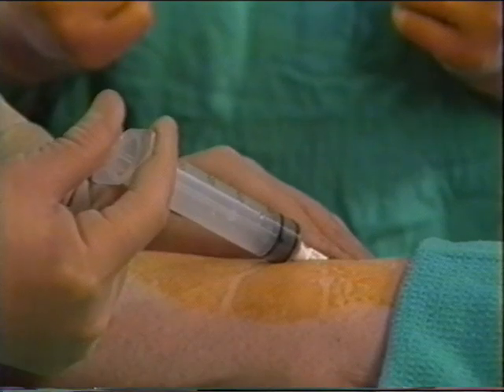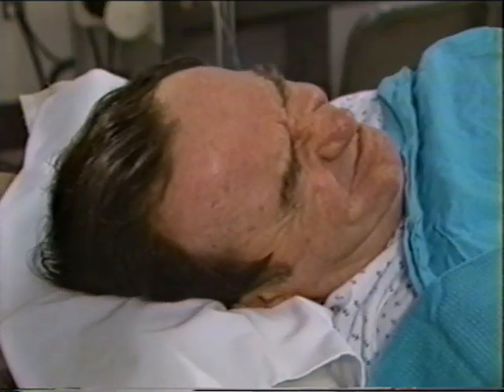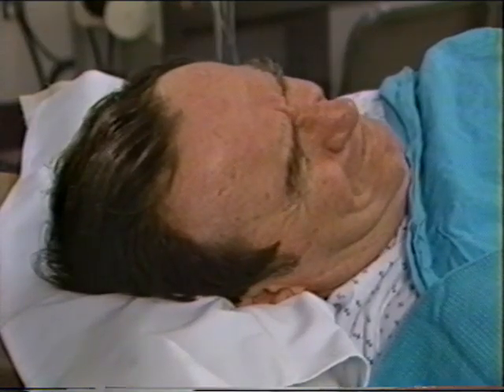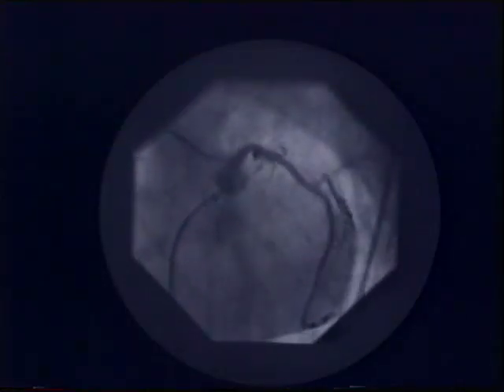Injections may be made into the coronary arteries and also into the heart chamber. During the time the dye is injected, you may feel a warm flush. This feeling will last for 20 to 30 seconds. The dye that is injected into your heart can be seen on the fluoroscope screen.